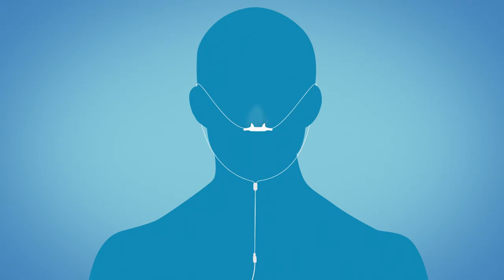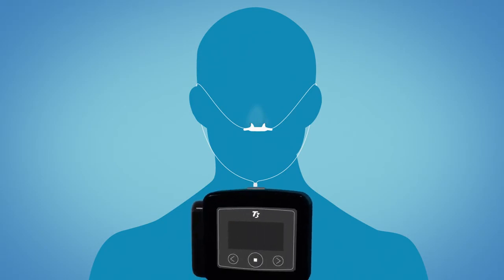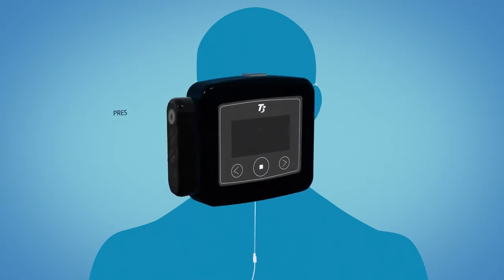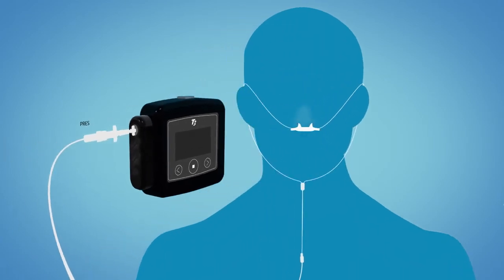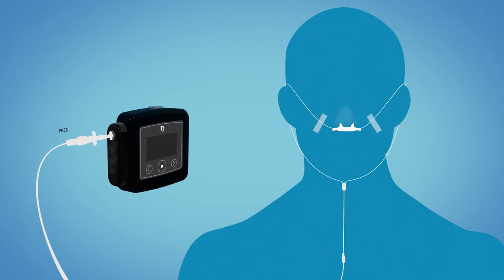Take the other end of the cannula and connect it to the side of the T3 device by pressing the end into the pressure input on the device. Put a little piece of tape on the cannula on either cheek to hold it securely in place.